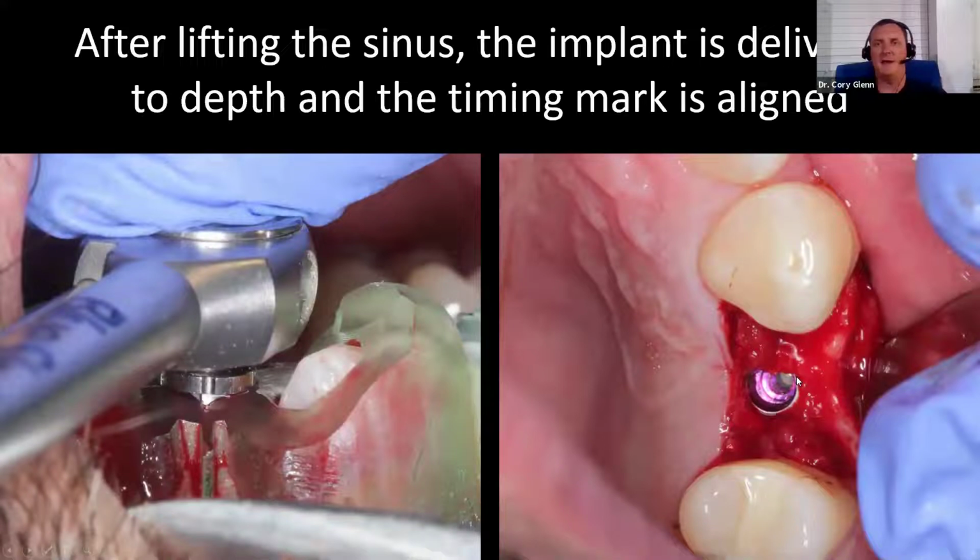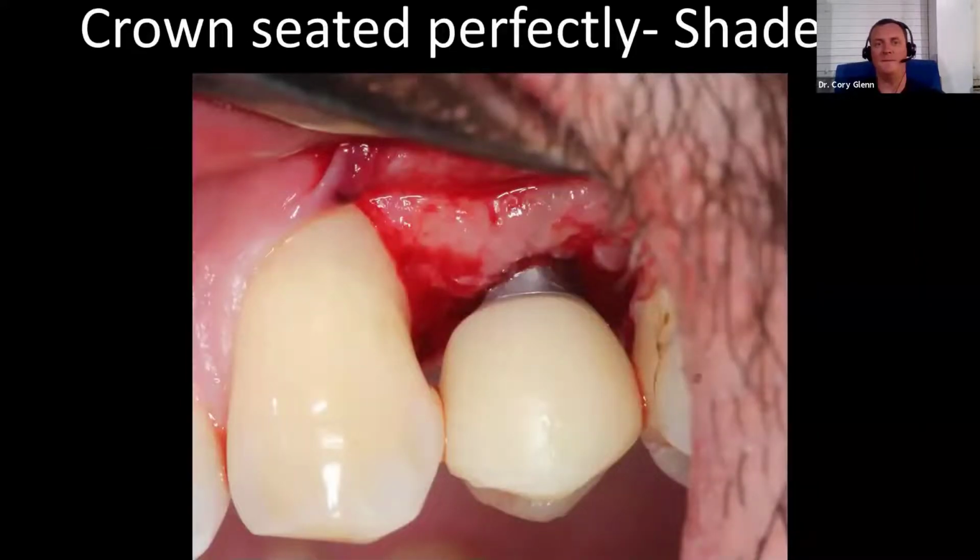Now, again, in theory, if everything was accurate, we should be able to take the pre-made final restoration and it should just drop into place and torque all the way in. And sure enough, it did. And I didn't even take a shade on this guy. Again, everyone in my office, or my lab, I guess you'd say, is an A2. And thankfully he was an A2, so it worked out great, because otherwise he was going to have a mismatched tooth, but he wouldn't have cared.